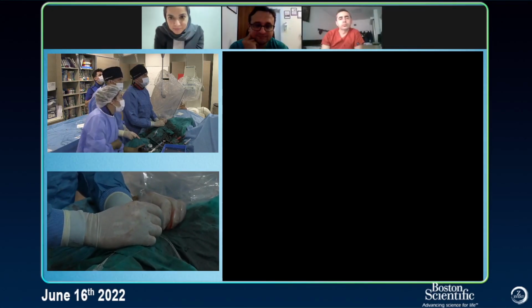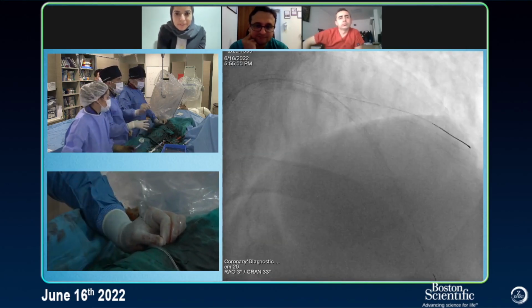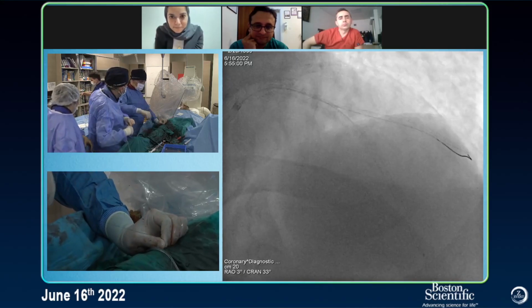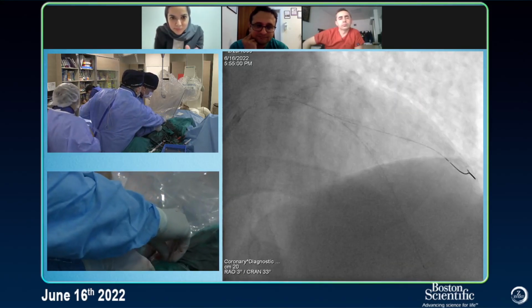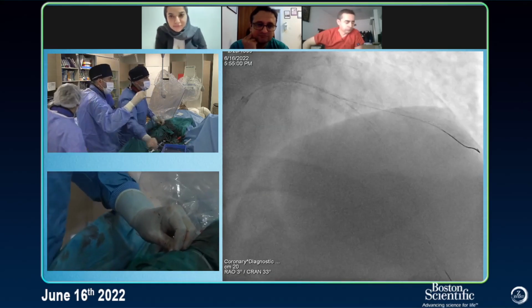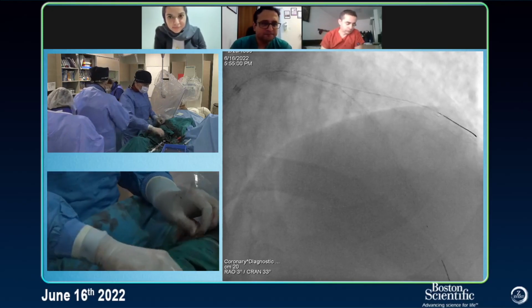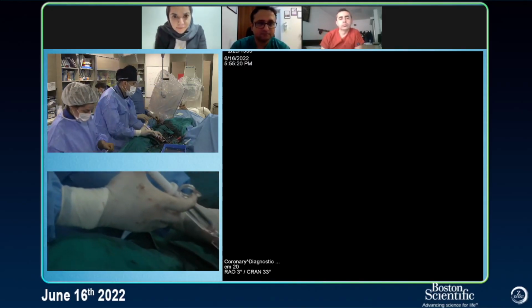Go up. Okay, down. Now 2.75 for diagonal and or 3.75. Normally 3.5 is enough, but distally 3.0. What do you think? So guys, distally, let's see its size and tell me if I can go 3.5 all the way.